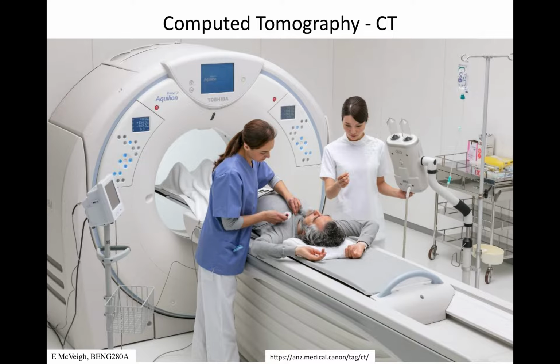So we're going to look at the hardware and just the methodology of collecting data to create computed tomography images. This is from the first lecture, where this is a standard CT scanner. It's basically a cylinder, and the patient is on a table. That table can move with precision in this direction, the superior-inferior direction, or the Z direction. And the precision of those motions is fairly high, sort of 1/10 of a millimeter, something like that.